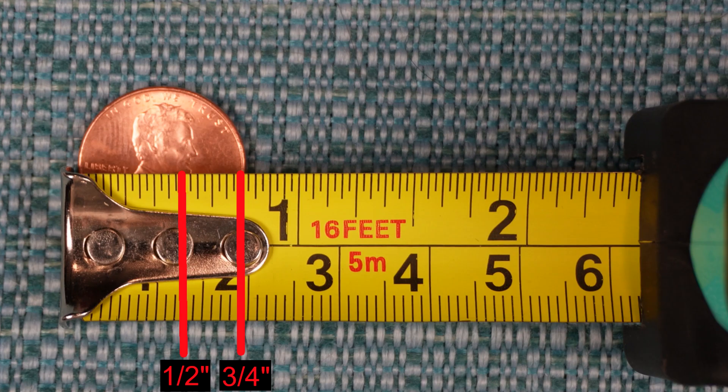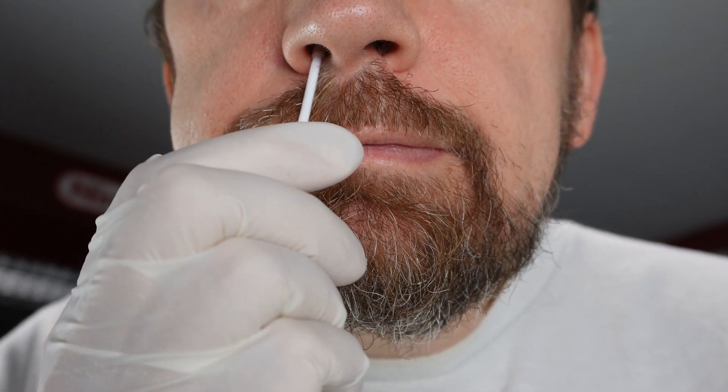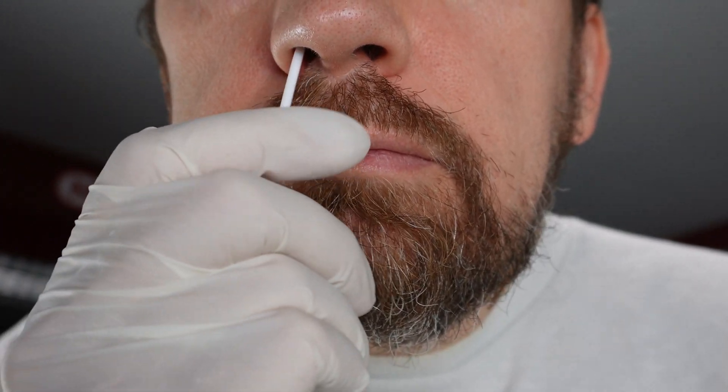By the way, three fourths of an inch is about the size of a penny. The noses of children will be smaller, of course, so you do not need to go in as much. It says to rub and rotate the swab against the inside walls of your nostril, so you want to be spinning it a little bit as you circle the inside walls.